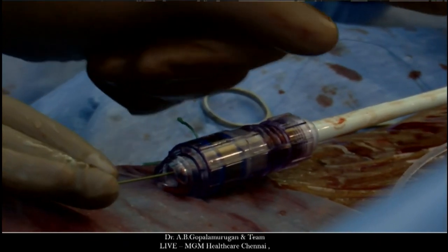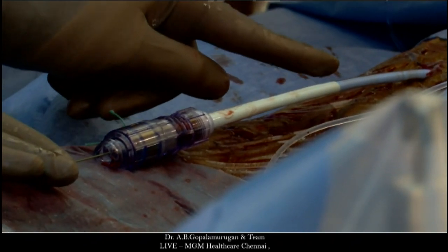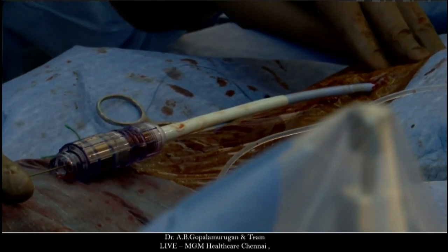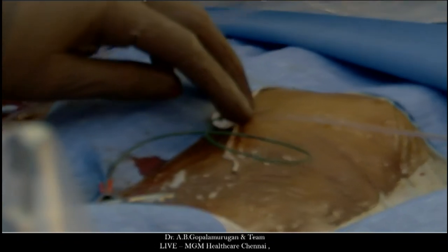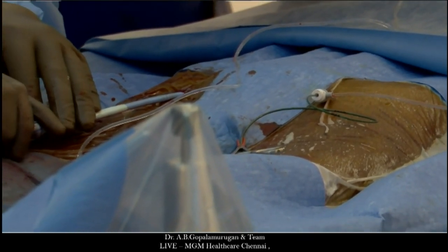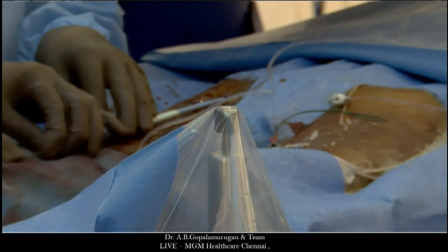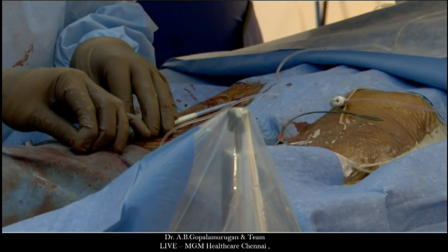So you can see here on the camera, this is an e-sheath here. I have not inserted it as much because I know I need some critical length to be able to load the valve in the IVC. That's why I've not snugged it fully in. On the right side camera. On this side, on the left side, we have a temporary wire. No arterial access, obviously. We have an art line from the radial, from the anesthetic side. But usually, we don't need an arterial access unless extremely complicated. We have to snare it to create a VA loop. In a balloon?